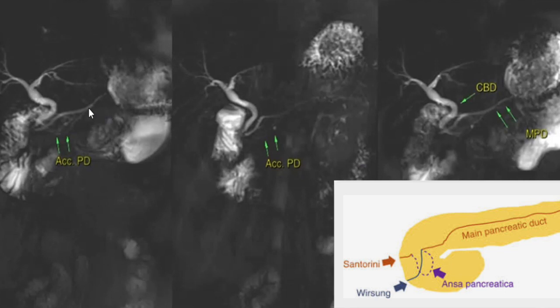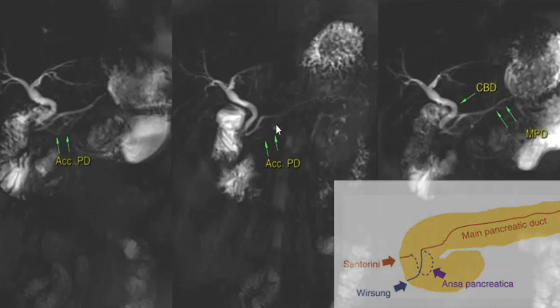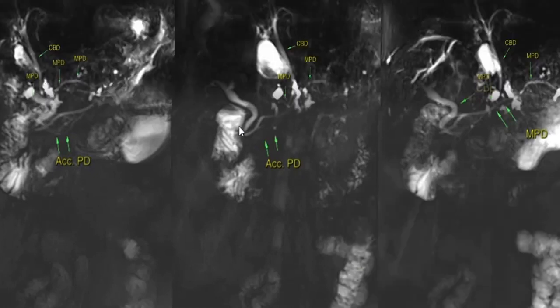Here is another example of ANSA pancreatica. An accessory pancreatic duct is seen arising from the main pancreatic duct. It is seen to descend down, then ascend upwards, forming a loop, crossing the CBD and finally terminating into the minor papilla. Findings consistent with ANSA pancreatic duct.